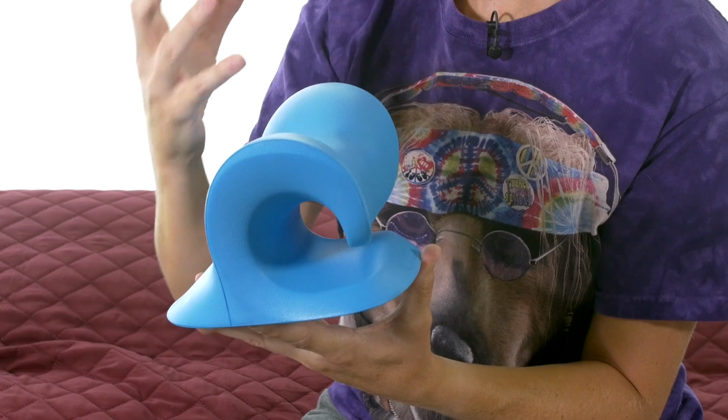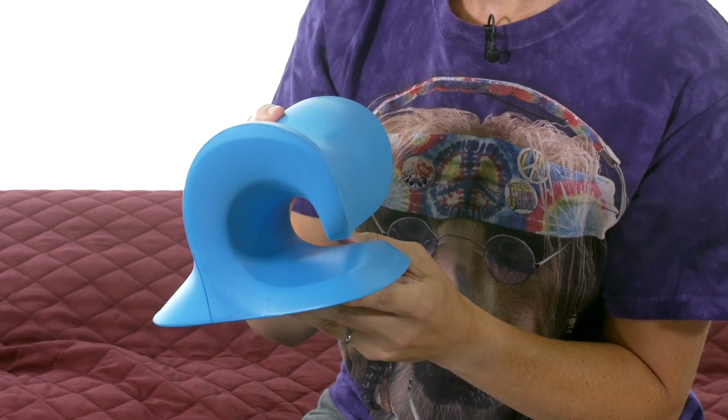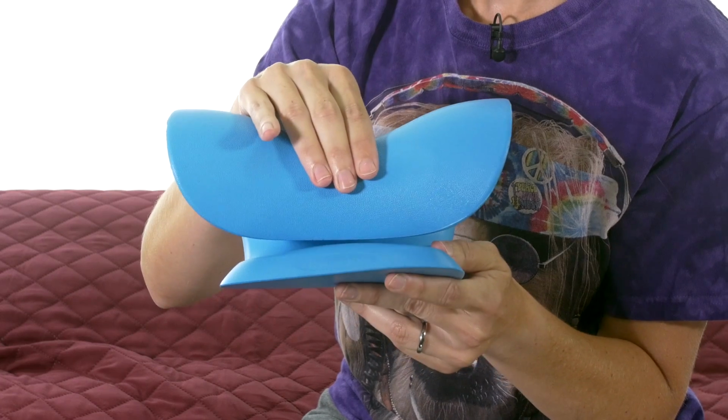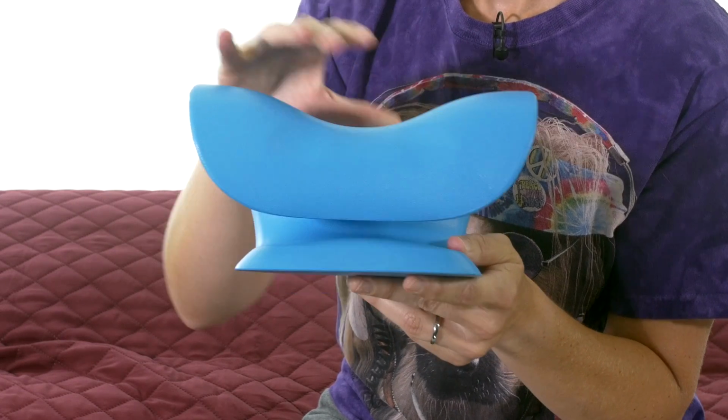Also, a great thing with cervical traction is that there are a lot of pieces of equipment that you can use at home, after maybe you've tried it in a clinic and found that it's helpful for you and that you are supposed to be using it. So the Restcloud Neck Stretcher is what I'm going to use today to show you some cervical neck traction. I really like these kinds of things because, one, it's super portable and lightweight, so you can take it with you and use it everywhere. If you use a machine in a clinic, sometimes they're big and bulky, so this is a great way to get that same kind of cervical traction without big pieces of equipment.